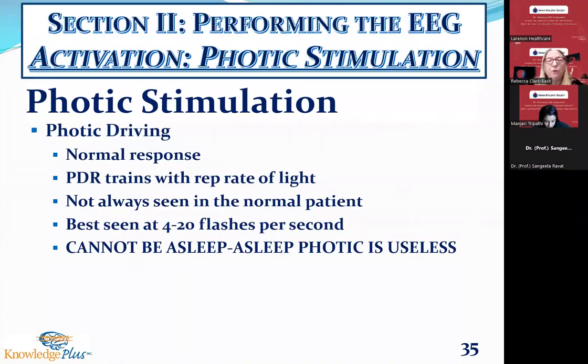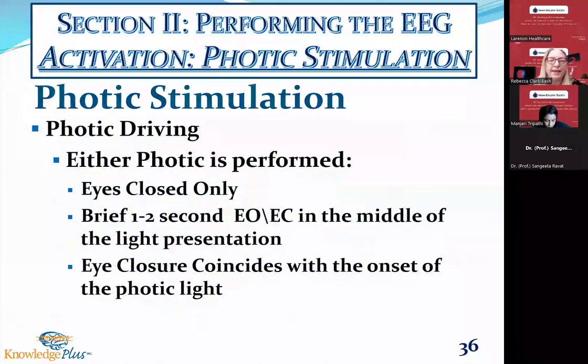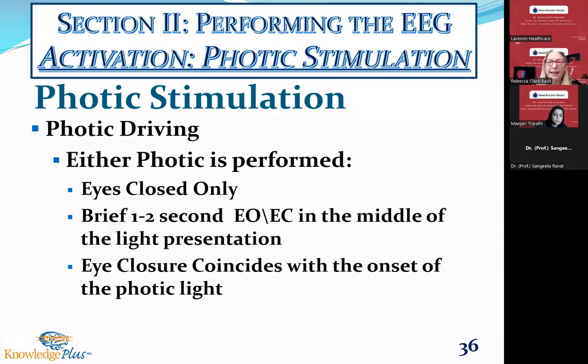If you do photic during sleep, if the patient's kind of drowsy and you're like, open your eyes, close your eyes, you're not going to get any diagnostic yield from that. Now, there are several philosophies on the best way to do photic driving. So either photic is performed the entire test with eyes closed only. I have always been a part of an institution that uses eye opening and eye closure in the middle of the light presentation. So the light starts to flash and I'll say, open your eyes, Helen, and close your eyes just for a couple seconds. And that can trigger a photoparoxysmal event.